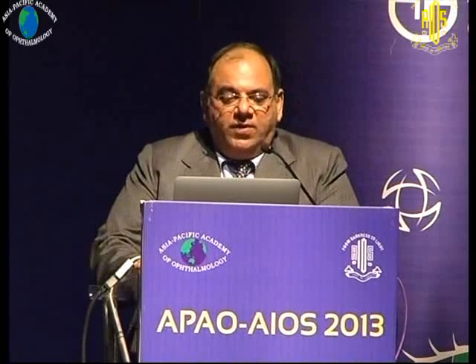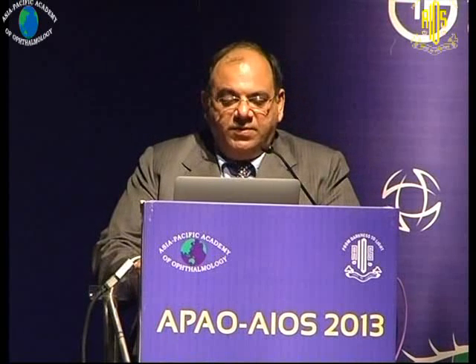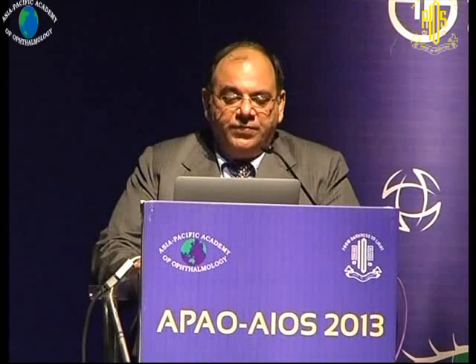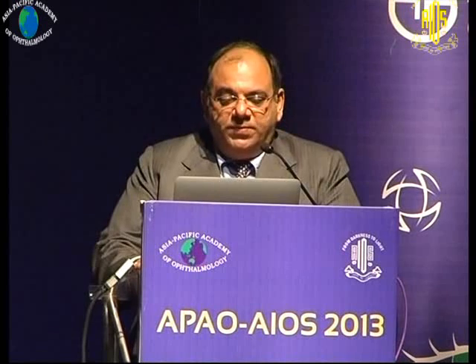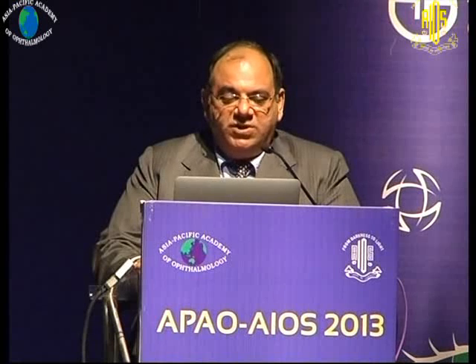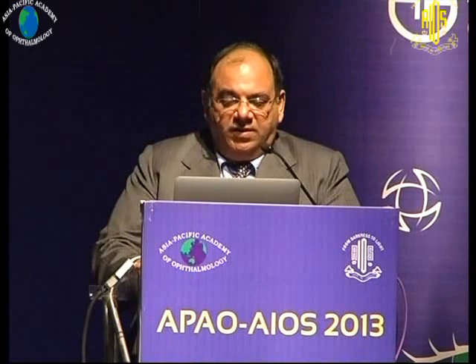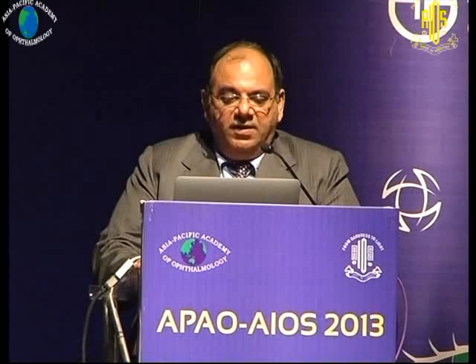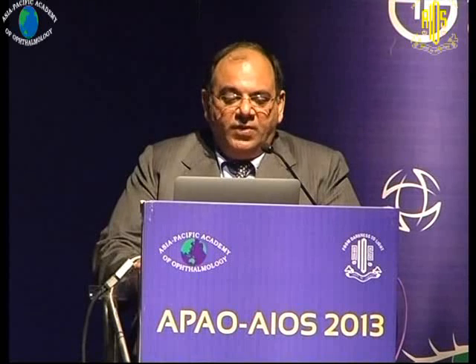Combined cataract and vitreoretinal surgery gives us an opportunity to address both the cataract and posterior segment pathology as a single-step approach. Elderly patients with pre-existing nuclear sclerosis are suitable candidates for combined surgical procedure, and rapid visual rehabilitation is one of the main advantages of this procedure with a single surgery. We have a better visibility of the posterior segment for peeling. There is good access to the anterior vitreoretinal structures.